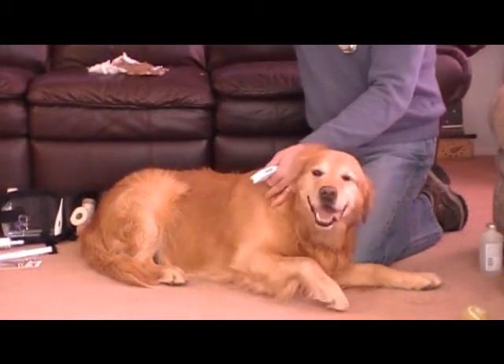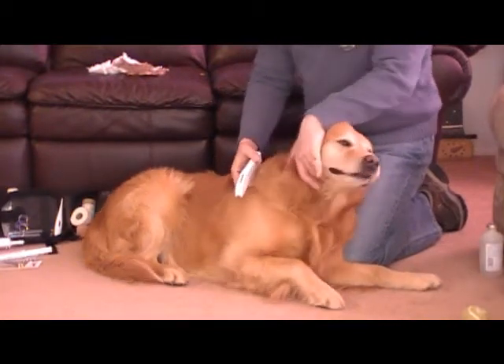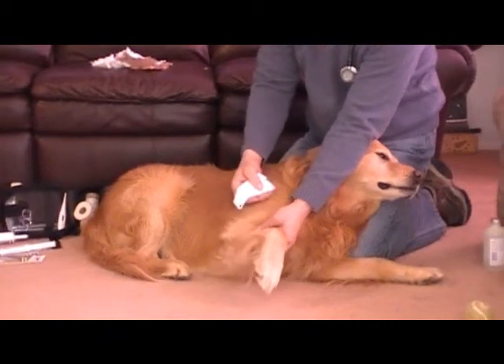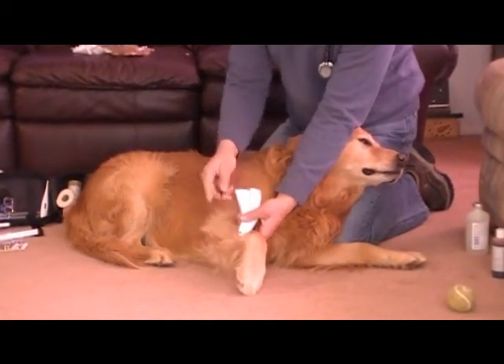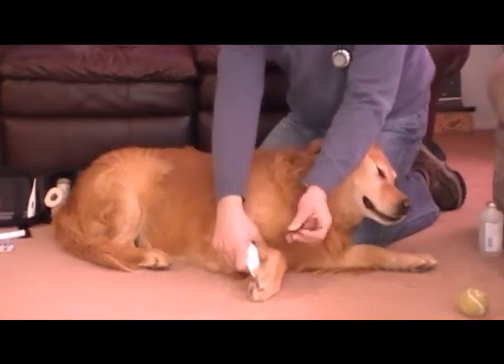This goes back to muzzling first of all for safety, and a lot of times animals will actually allow you to do this. So if you have a wound that you think you can close — and once again, this is for a pinch — use the thumb forceps for tissue handling and pull the wound edges together.